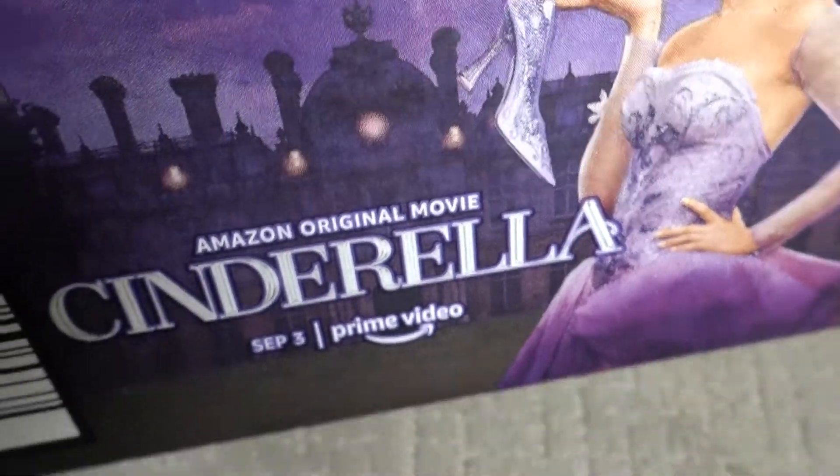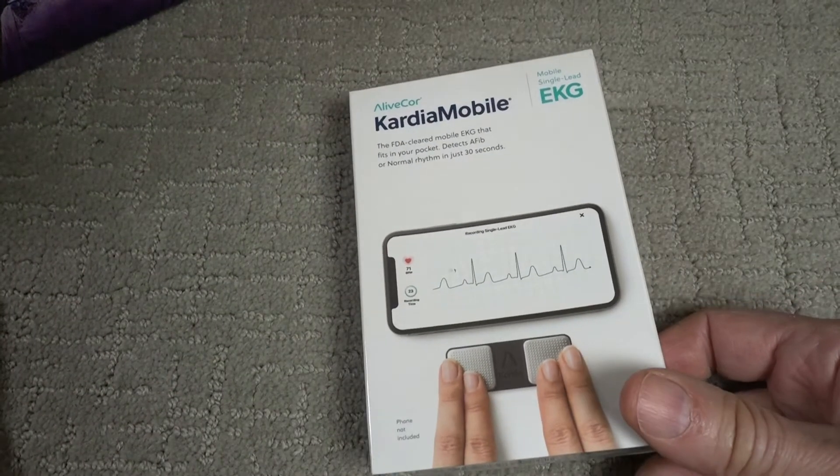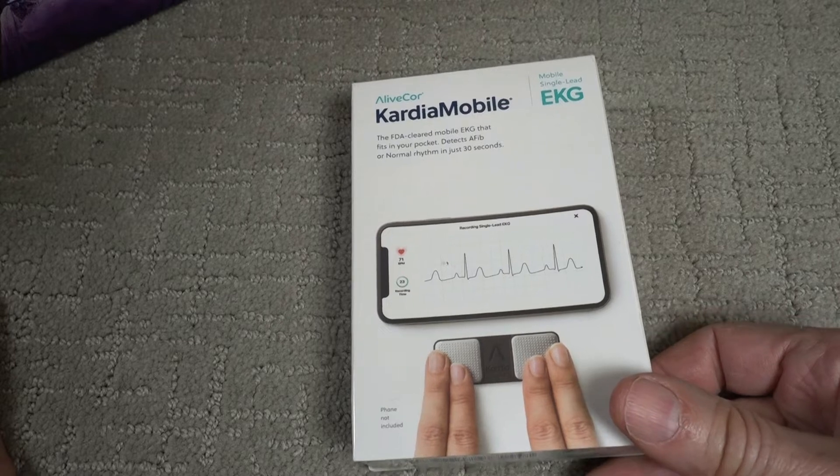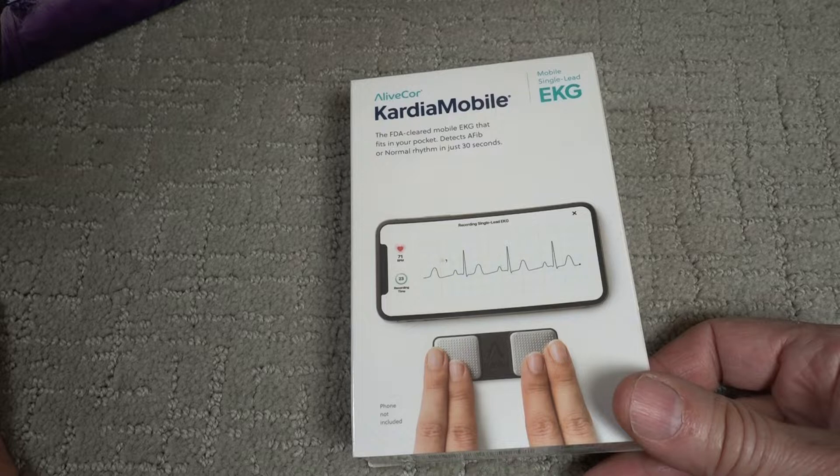No, I didn't switch teams. This is just a shipping box. Hello, David here, and the project for today is a review of the AliveCore Cardia Mobile EKG Reader.